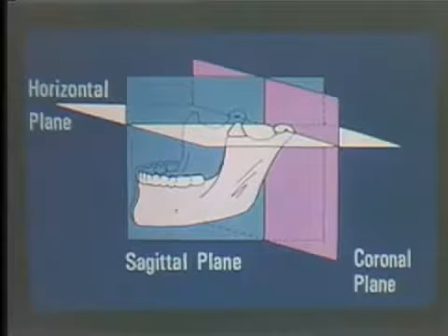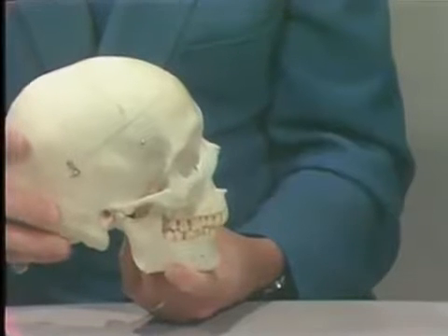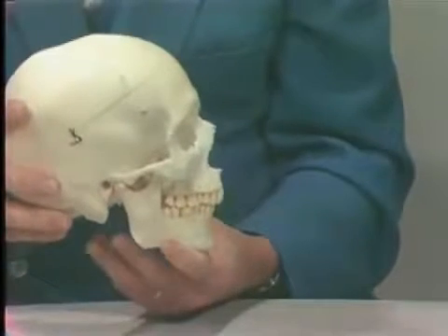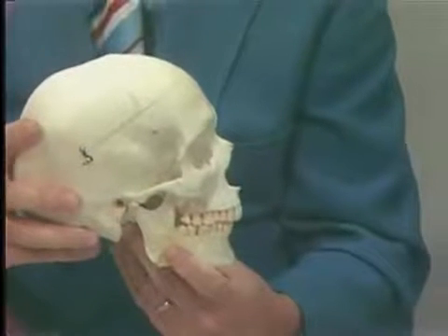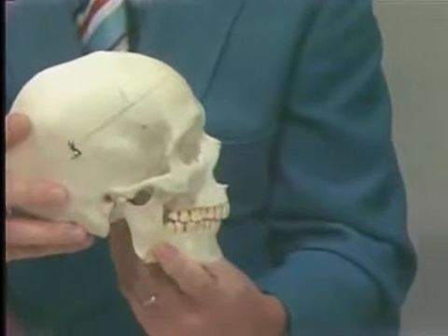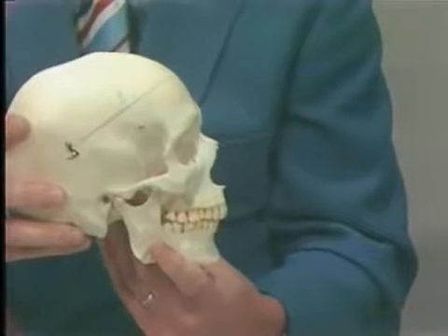We'd like to demonstrate now the border movements, Posselt's border movements in the sagittal plane, and we'll do this with a schematic drawing, and at the same time relate the movement of the mandible to show you the envelope of motion that we have.